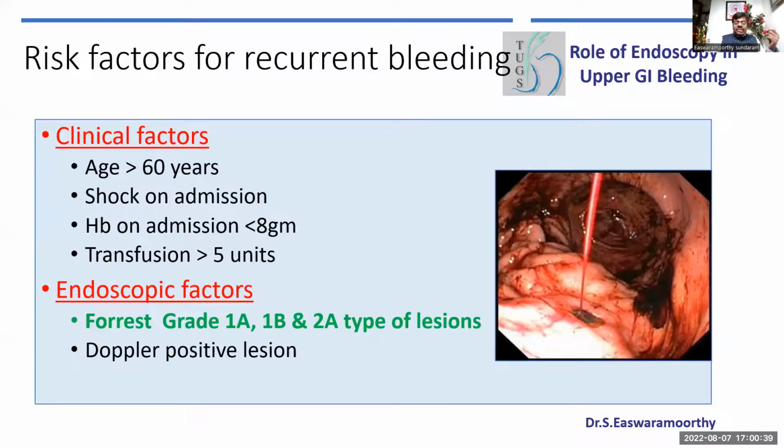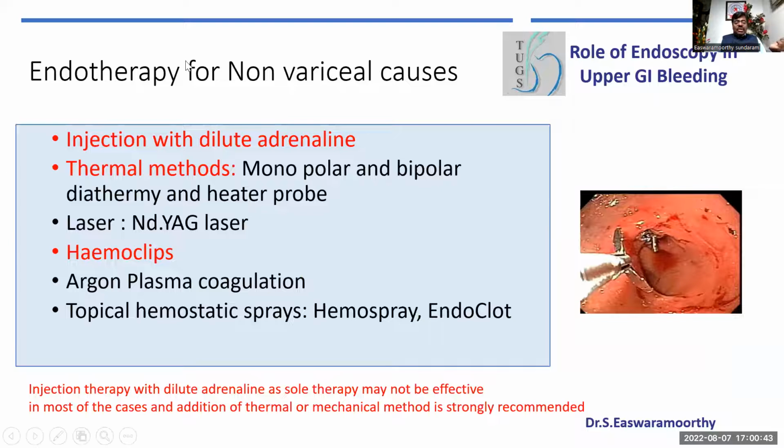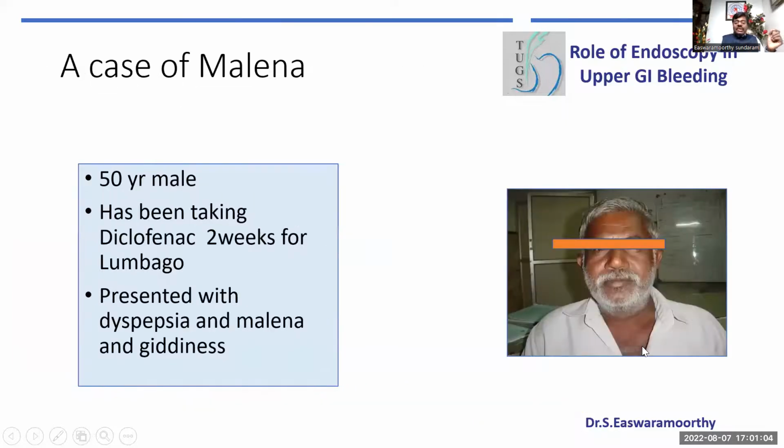Also, there are occasions, sometimes even as a surgeon, when I need to take them to OT. These are all the modalities I have. Still, as a peripheral surgeon, I feel a good usage of this, a cheap, effective way. But now I do not use it as solo. I usually combine it with either a thermal method, occasionally with hemoclips. So this injection of dilute adrenaline does help.